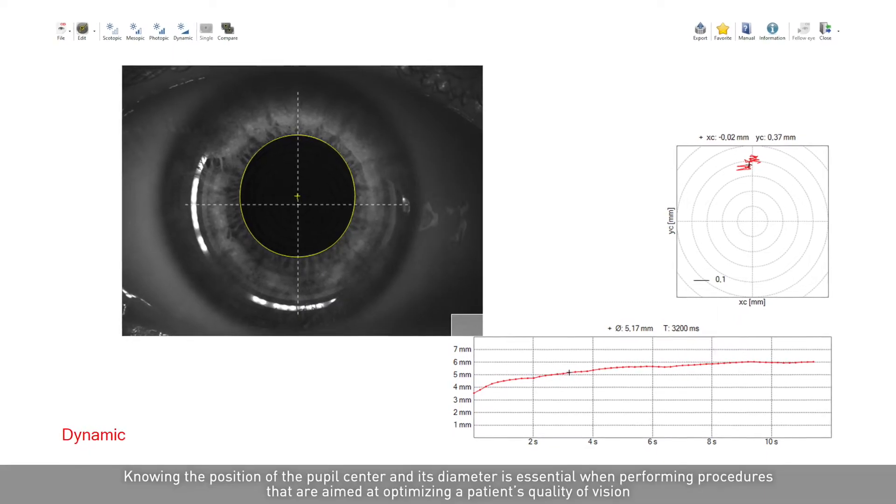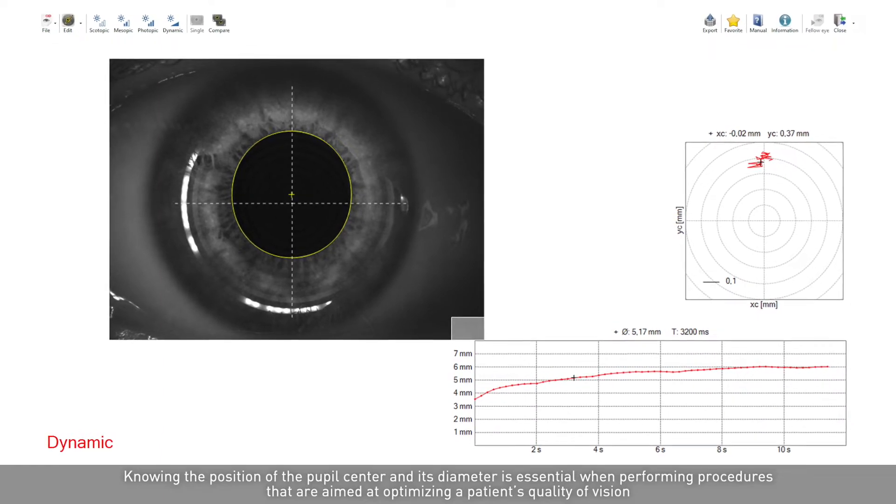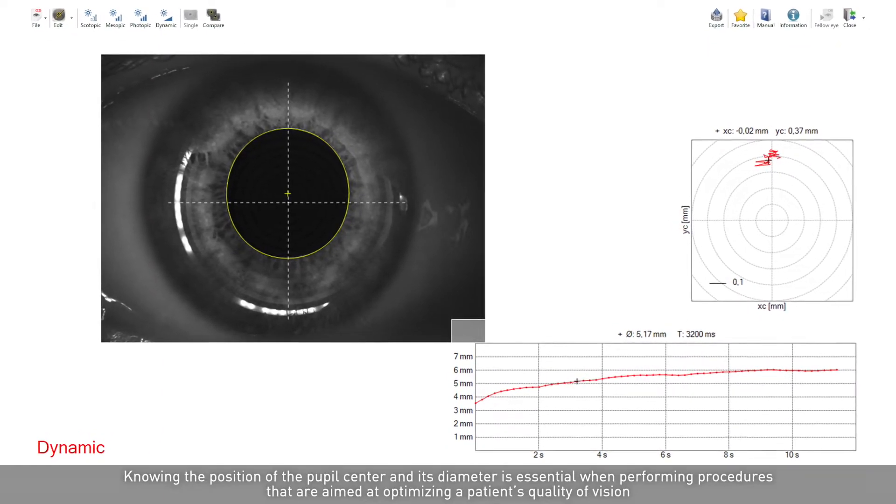Knowing the position of the pupil center and its diameter is essential when performing procedures that are aimed at optimizing a patient's quality of vision.